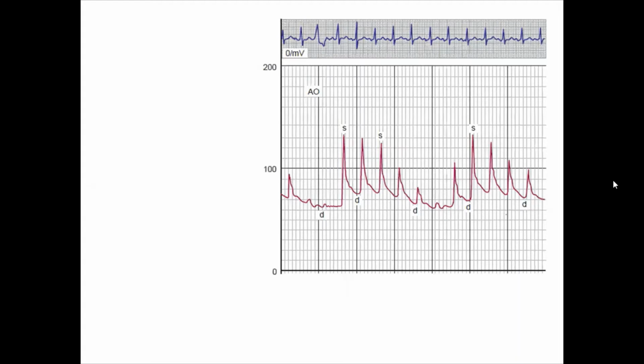ECG, which shows electrical alternance. Drop in the aorta. Just concentrate, see what happened in the aortic pressure. The ECG, what do you think about this ECG? It is sinus tachycardia and there is electrical alternance in the ECG. So, okay, is it electrical alternance? I mean beat to beat variation or something else? No, it is not beat to beat. Yeah, it is sinus tachycardia.